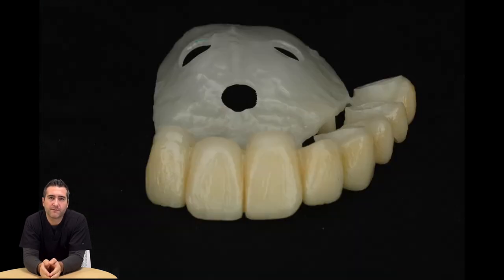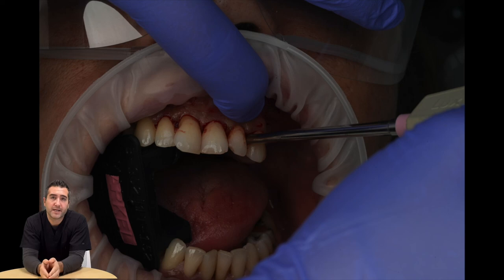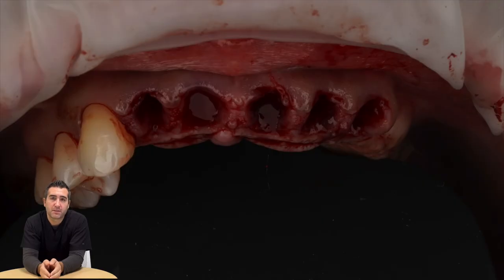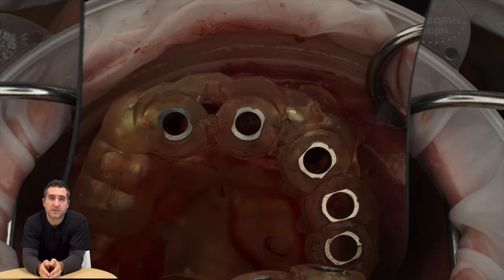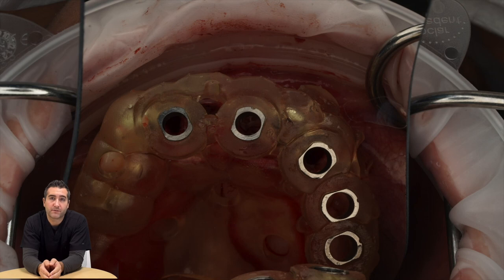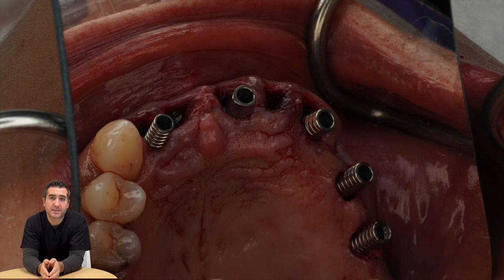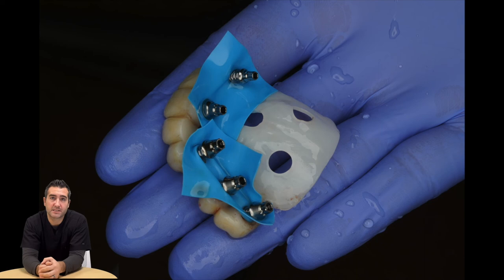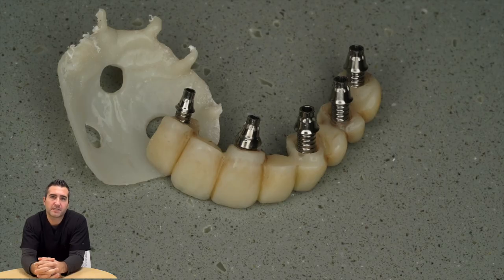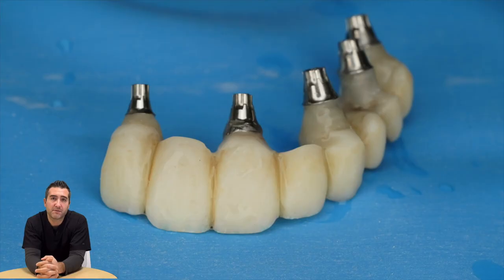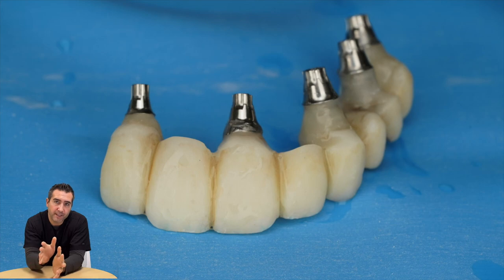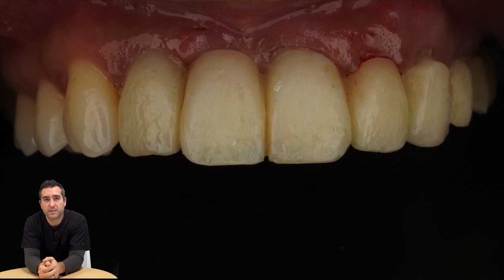So there it is milled, beautiful 3D printed surgical guide, the sleeves are all appropriately fitting out of Romexis, there's the palate, they're connected. So day of surgery, atraumatic extraction, in this particular case where we're going to go ahead and pop that surgical guide in. This is all done flapless in this case. You can see the beautiful fit of the surgical guide here. Retention pins are in, implants replaced, the temporary titanium cylinders are placed, the prosthesis slides right in. We go ahead and pick it up using flow composite or a resin cement or whatever you want to use and that's what it looks like immediately after pickup. We unscrew it, cut the palate off, and then we fine-tune that cervical area to fit it up to the abutment margin. And here we are screwed in.